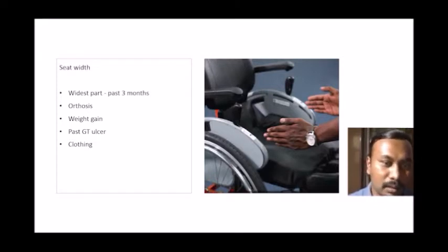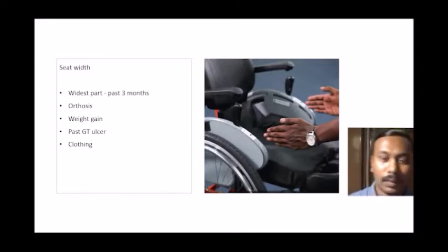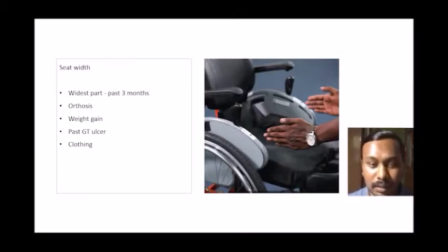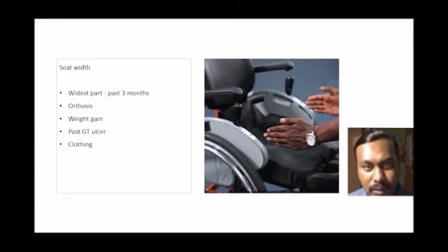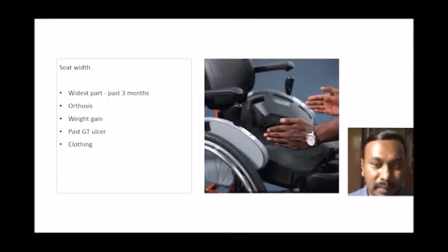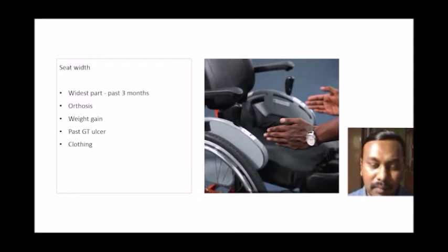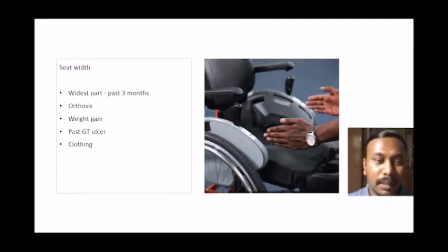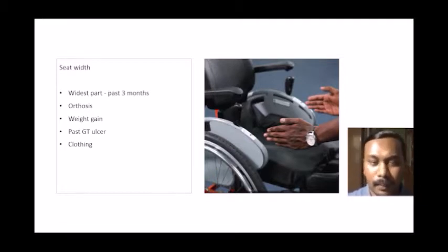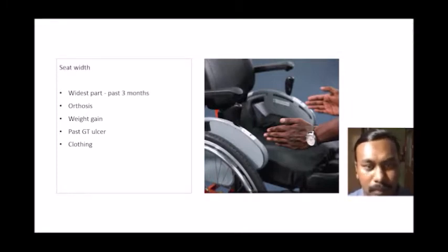If somebody uses orthosis or prosthesis while standing, measurements must be taken with the orthosis, or we can predict the thickness of the plastic socket and add it to the hip width measurement. We need to increase the seat width if the person is wearing orthosis. It's always best to take the measurement with the orthosis on for the most accurate result.